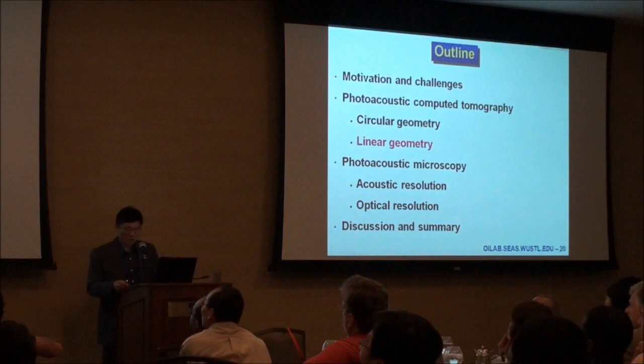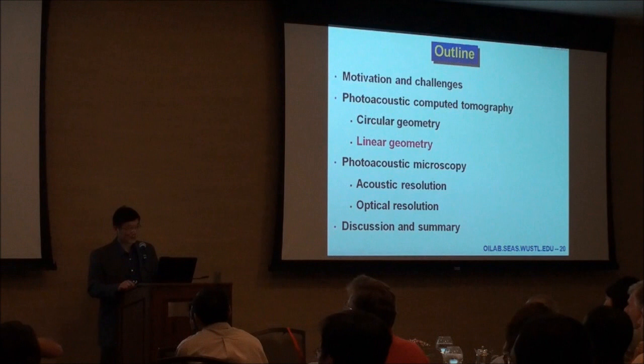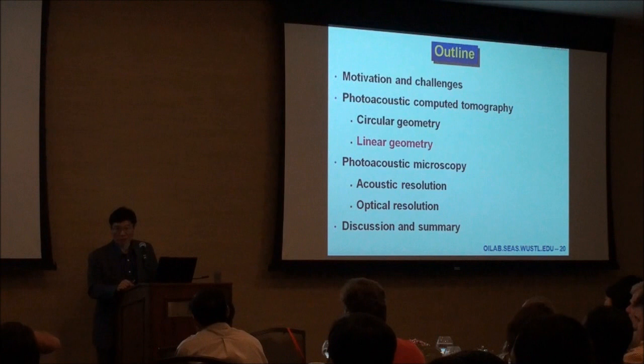As we know, functional MRI right now is the main technique for functional brain imaging, which is, one of the inventors worked here. It's a great technology. But this will complement functional MRI as well, because we image hemodynamics directly, because our signal comes from hemoglobin directly, right? So it's actually very sensitive to hemoglobin.